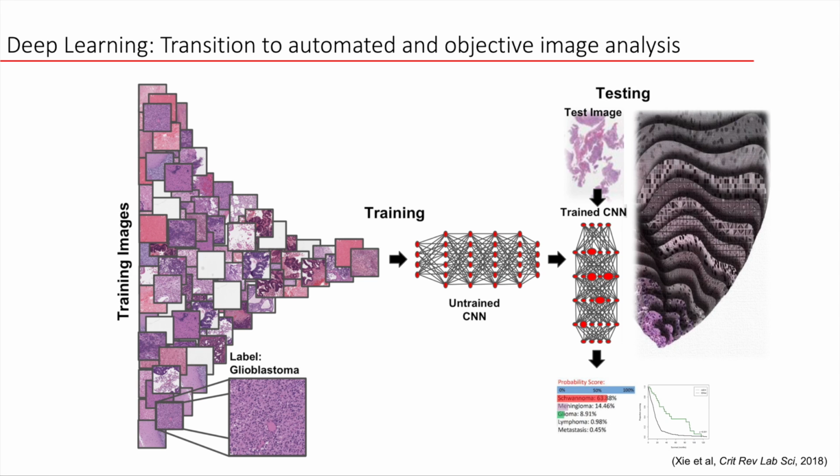And you can see here we have a test image of a schwannoma that's run through, and again it will look for the specific patterns that were learned from the training data, and you can see in fact this was classified correctly. And here's just a cartoon of what this may look like at the individual layer where things are aggregated together to form more complex objects.